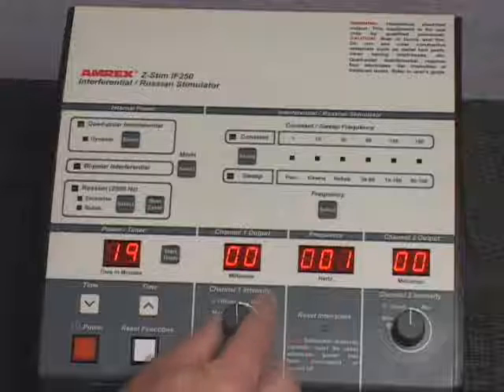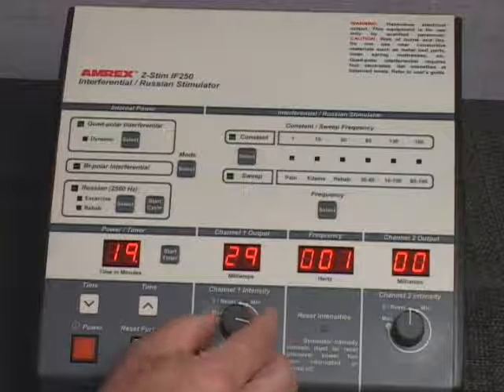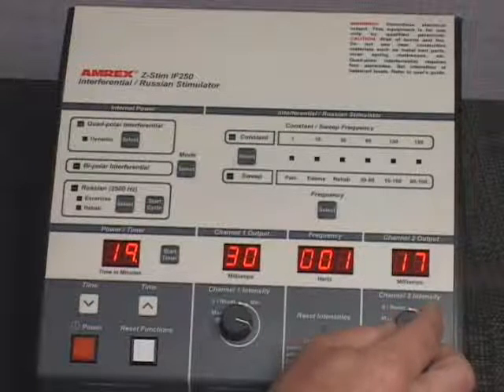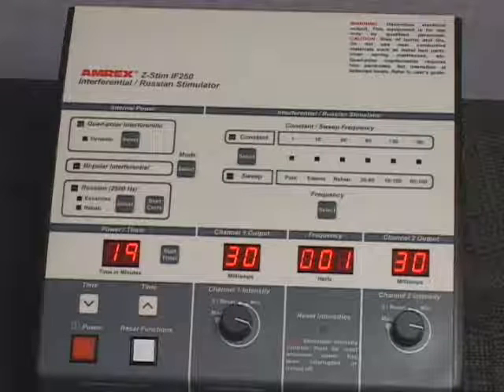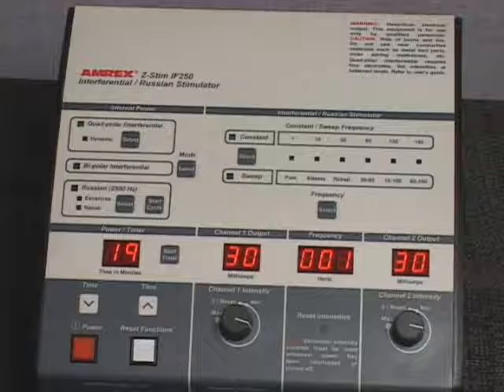Slowly increase the Channel 1 intensity to the desired output level. The Channel 1 intensity display will indicate the intensity selected. Slowly increase the Channel 2 intensity to the desired output level. The Channel 2 intensity display will indicate the intensity selected. The Channel 1 and Channel 2 outputs may be applied independently when treating in the Russian 2500 Hz modality. Intensity can be reduced or increased during treatment in the Russian 2500 Hz continuous mode only.